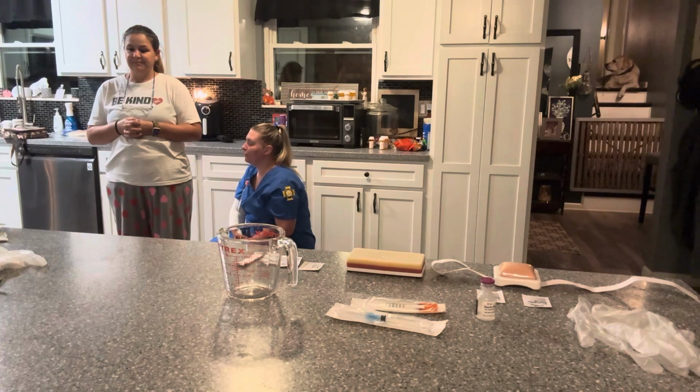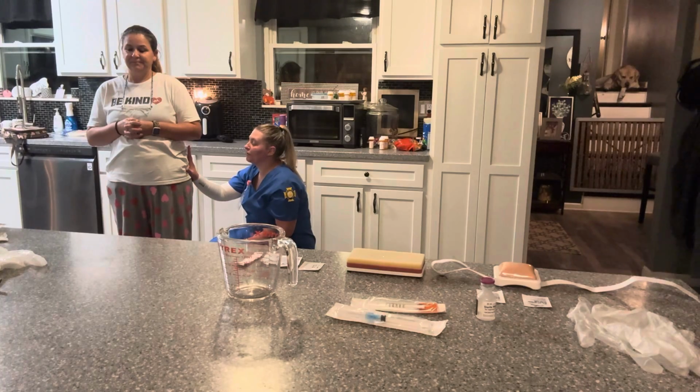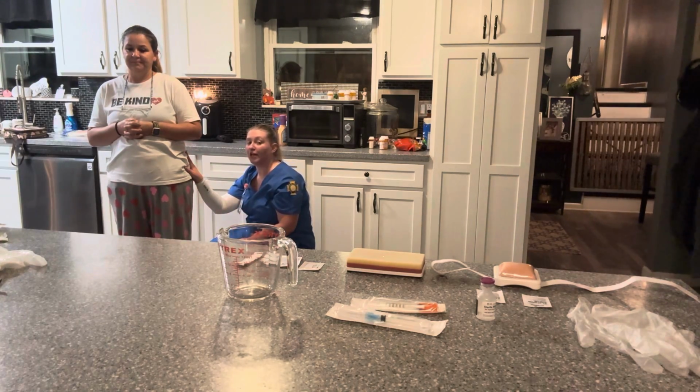For my ventral gluteal, I will put the palm of my hand on the greater trochanter, making sure that my thumb is pointed forward. My pointer finger is up at the anterior superior iliac spine, and my middle finger is rotated back to my iliac crest. And in the middle of that triangle is where I will give my injection.